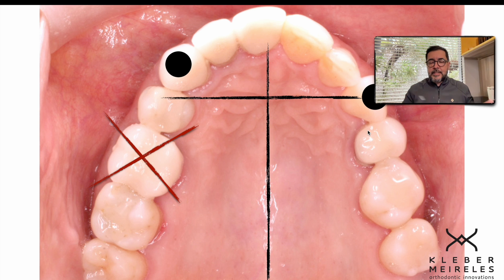For treating this case, I planned to do this extraction. But remember, everything must be based on diagnosis, and then you go to treatment planning. And after that, we will apply the best biomechanics that we can. In this case, my choice for closing the space was using loops.